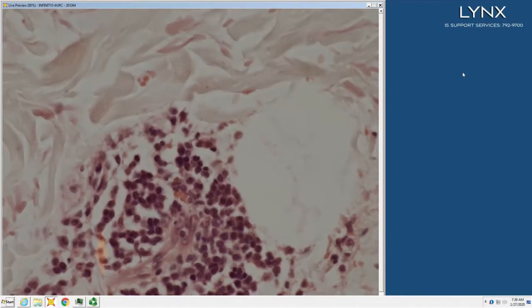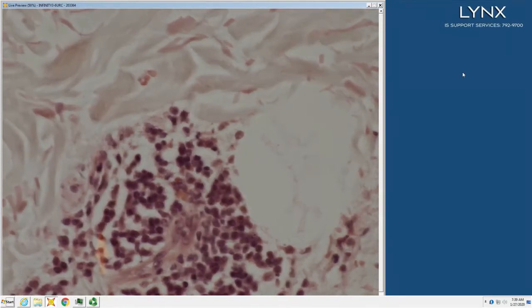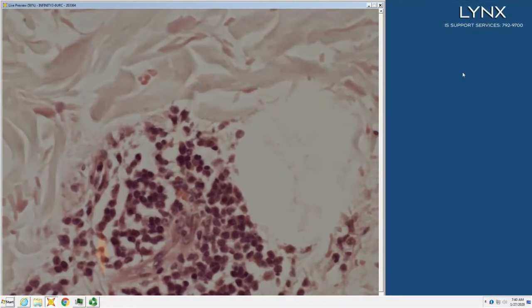In this case, you stain them. They stain for CD4. They don't stain for CD3. And that angulation and the peripheral rim of cytoplasm are also clues that it's leukemia cutis. Right? So non-specific perivascular lymphoid infiltrate versus you have leukemia and you have myeloid leukemia, that's a bit of a difference, right?